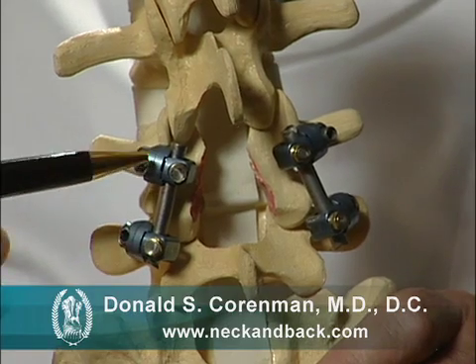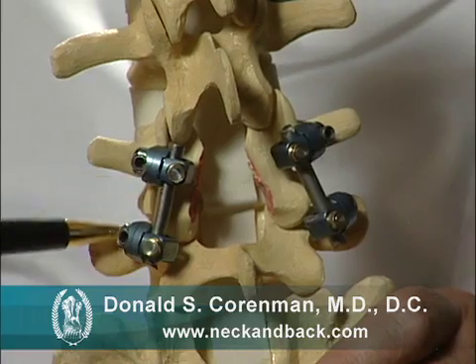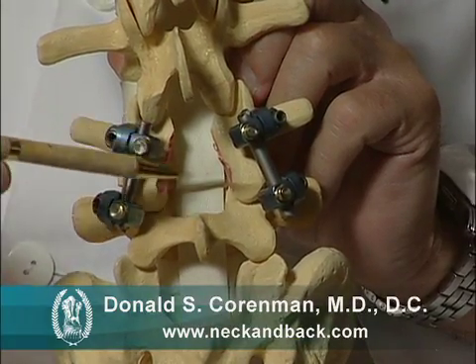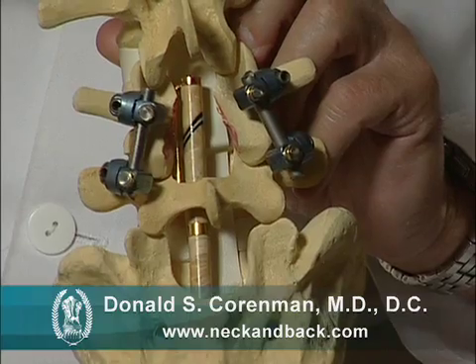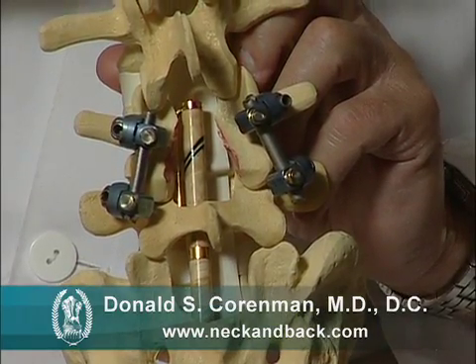You will notice that these bars are here to stop the motion. We then put the bone graft in here to create the fusion. You can see that this area has been opened up surgically, and that will allow the nerve roots, which live within the canal, to freely pass through this area out to their normal anatomic exits.